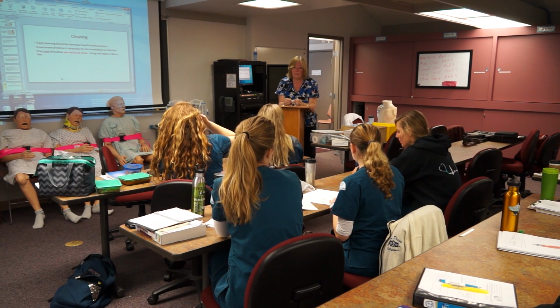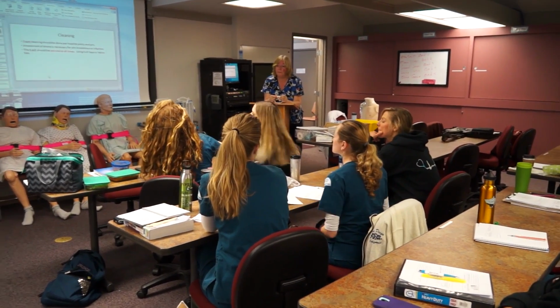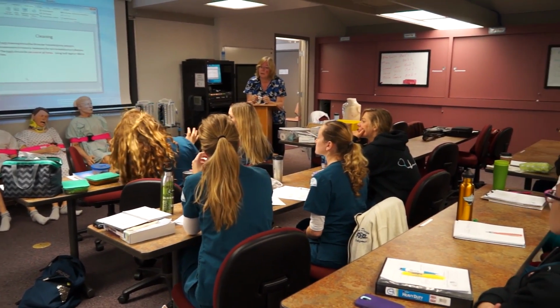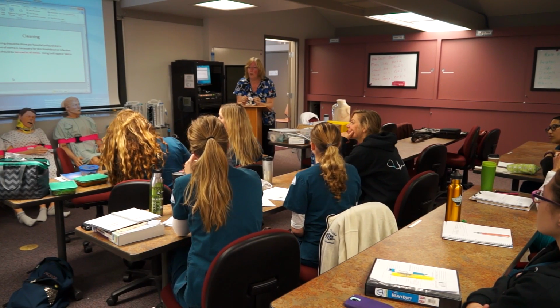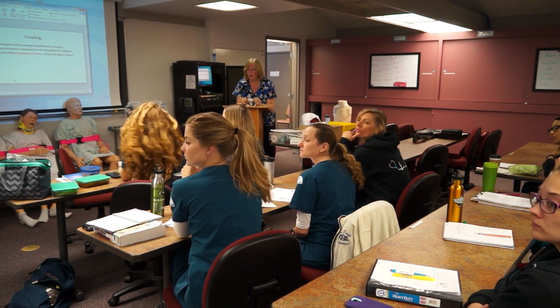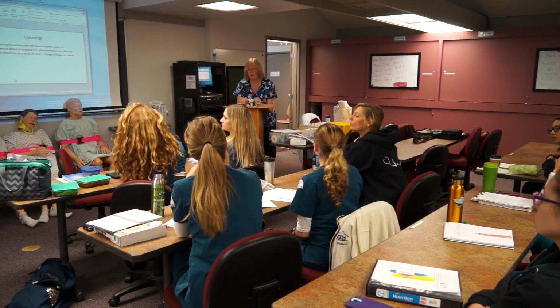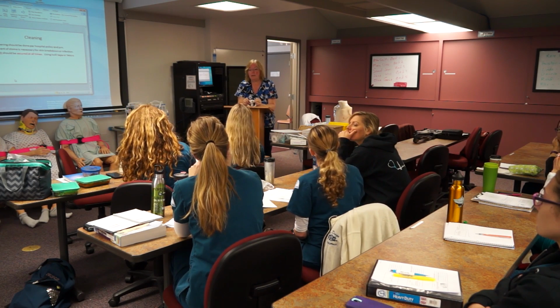Kat, you had a question. I'm a little confused about using the BVM. When would you use that versus just oxygenating them with the ventilator? When I don't have a patient that, like this patient over here, does not have any kind of ventilator, they're breathing only. They don't always have a ventilator. So if I have somebody that's not on a ventilator, I'm going to use the bag valve mask.